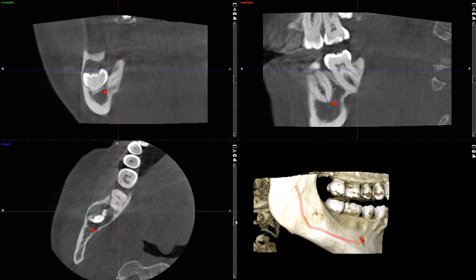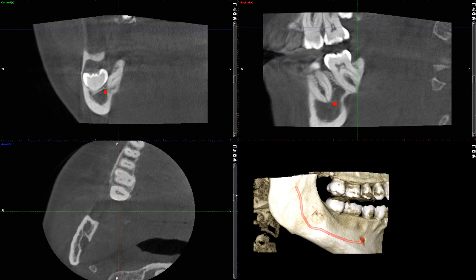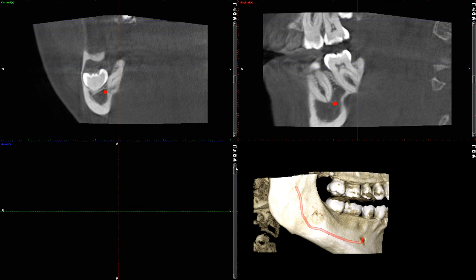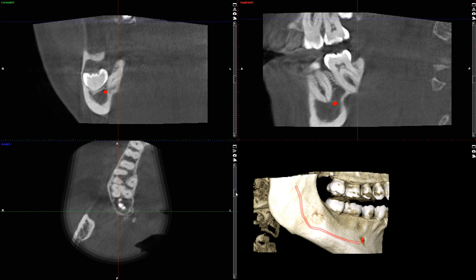Anyway, without further ado, let's take a look. I'll start from the top edge of the scan going through the axial view. Third molar, crown of a third molar, second molar, first molar.